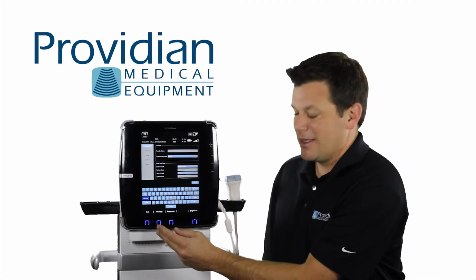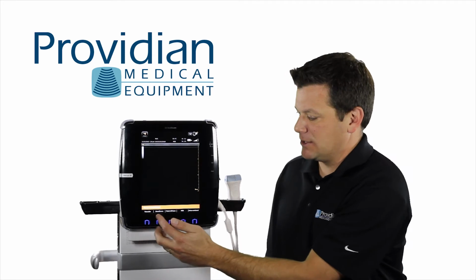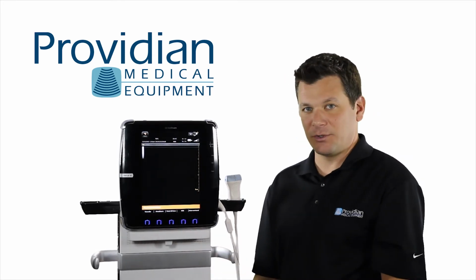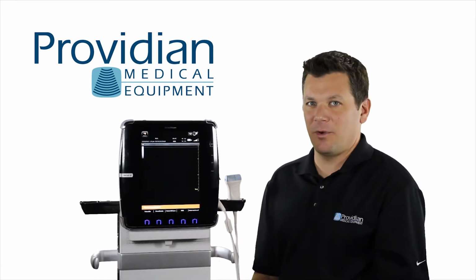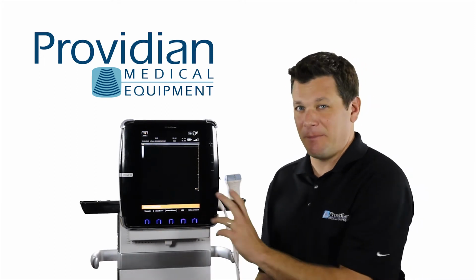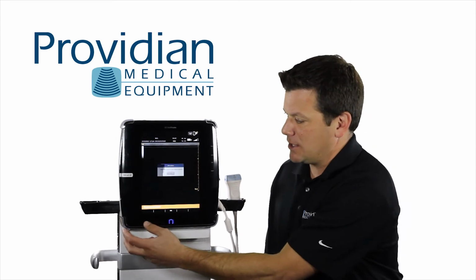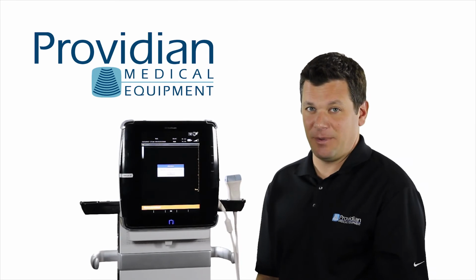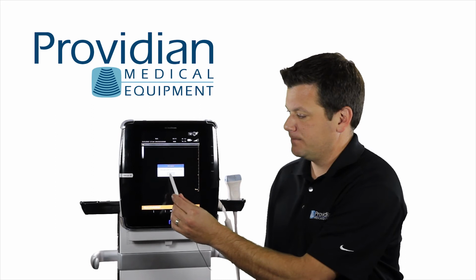Here I want to choose the package. I'll select package and it's going to say vascular, anesthesia, point of care, MSK, or interventional. So here's what I would choose for whatever I'm going to do most of the time. You can always change it, but each time you change the package on the system, it's going to reboot the system. So if I change to vascular here, it's going to say, please restart system to initiate the vascular package. I'm going to go ahead and do that now, and you'll see how the menus change down below.